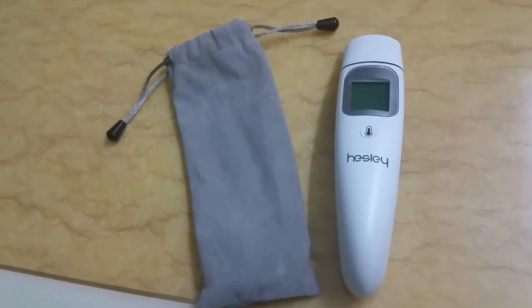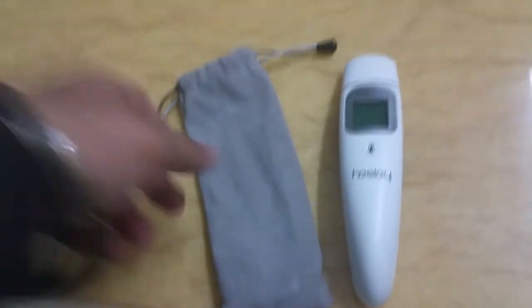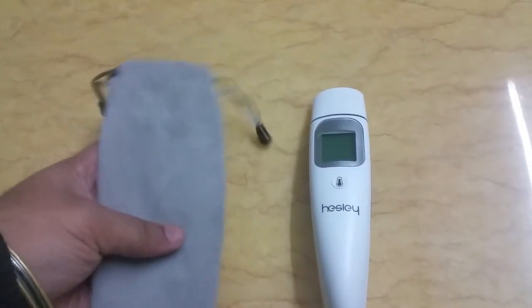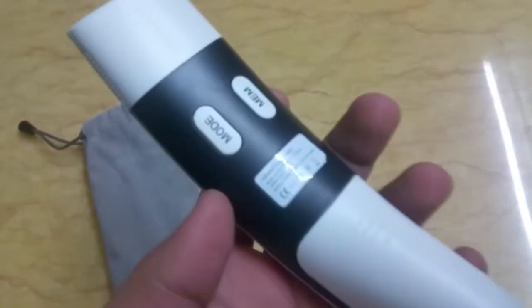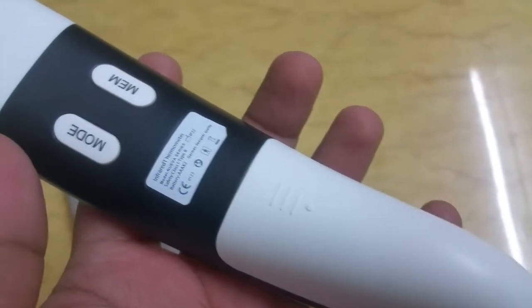Hey guys, this is Mr. Gadget Mix. Today we will be taking a look at the Hesley medical forehead and ear thermometer. If you are looking for a non-contact thermometer for your kids and adults, you have to take a look at the Hesley.